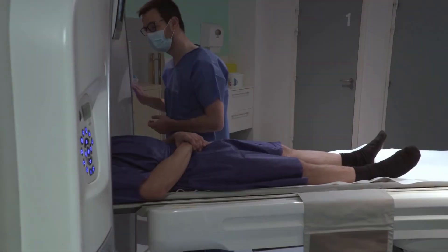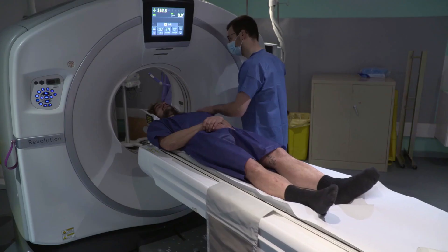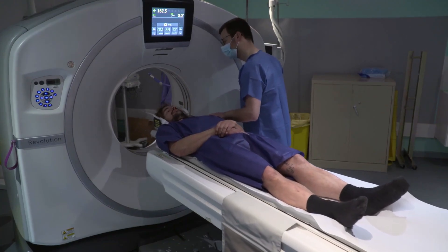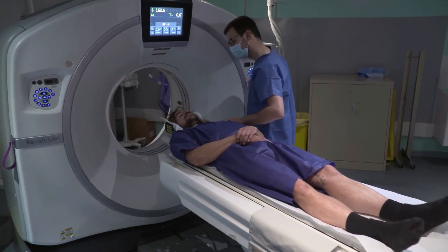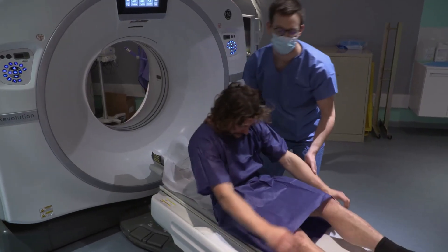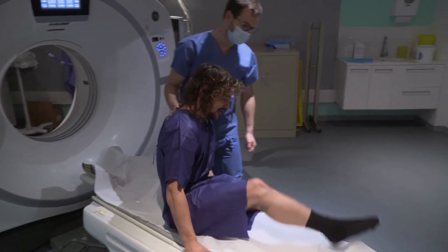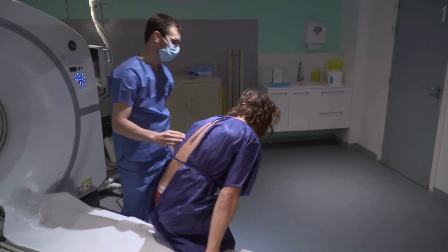At the end of the examination, accompany the patient back to the changing room and tell them they can get dressed. Provide the patient with any post-examination instructions as indicated by your facility.